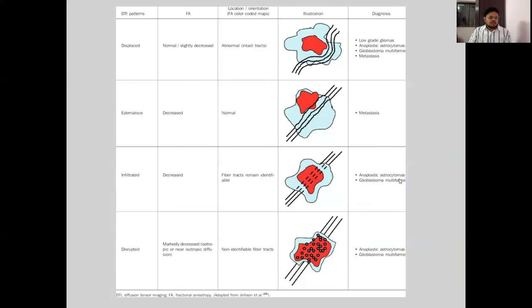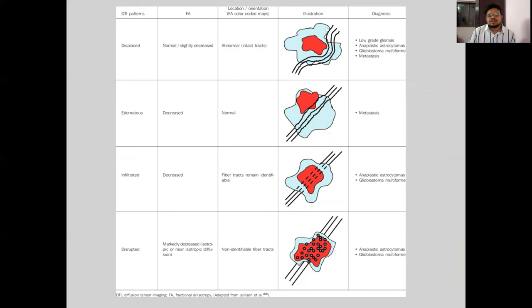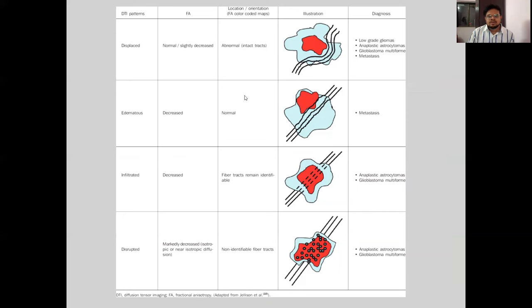Using this principle of DTI, we can analyze the effect of tumor on white matter fibers. Some tumors can cause displacement of white matter tracts — in those cases the white matter tracts are intact. In some cases, tumors can cause edema of the white matter tracts; the tracts remain intact in that case as well, however the fractional anisotropy is decreased. Some tumors can infiltrate into the white matter tract, causing reduction in fractional anisotropy.